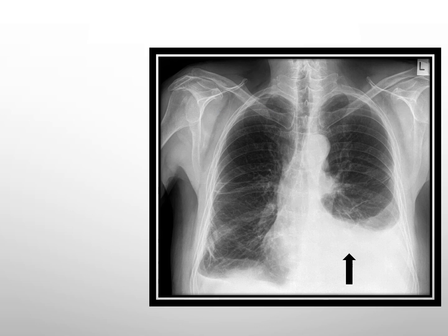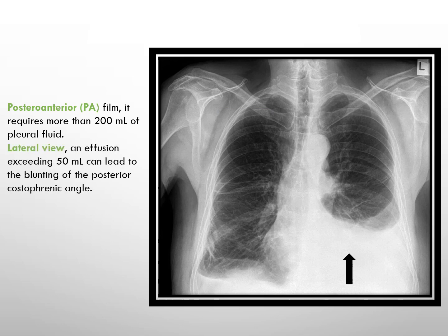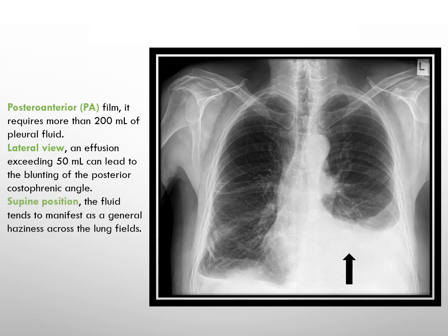The presence of dense opacification in the lung fields with a concave meniscus is a characteristic sign of pleural effusion. To visualize this on posterior-anterior view, it typically requires more than 200 ml of pleural fluid. On lateral view, an effusion exceeding 50 ml can lead to blunting of the posterior costophrenic angle. In a supine position, the fluid tends to manifest as a general haziness across the lung fields. This x-ray shows pleural effusion visible on the posterior-anterior view.